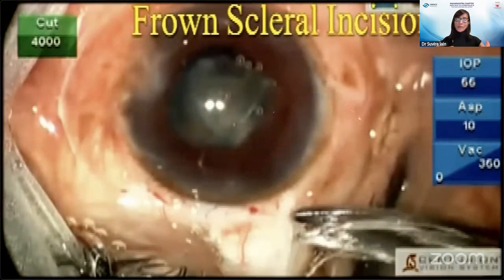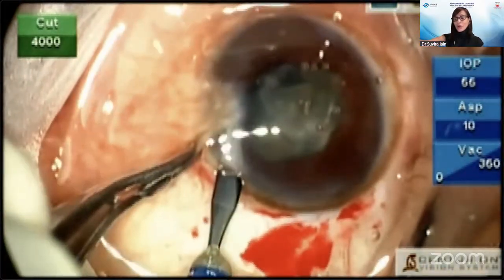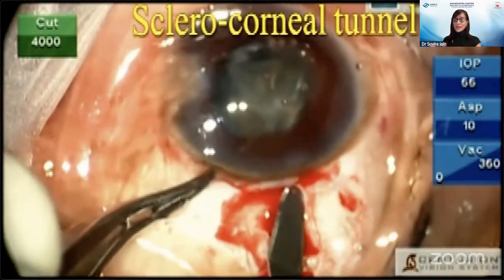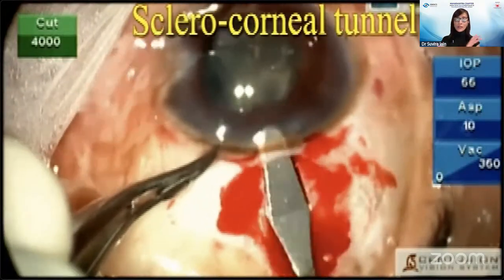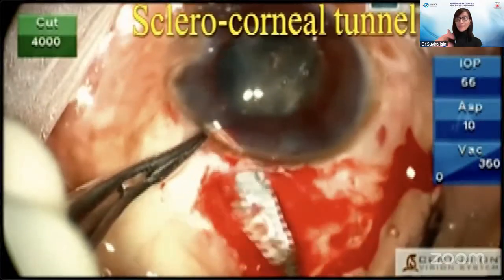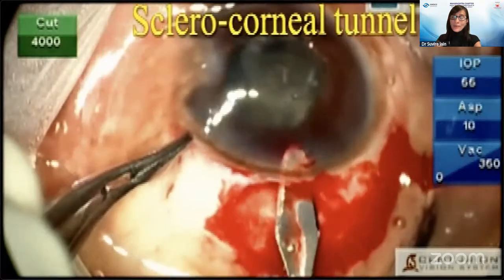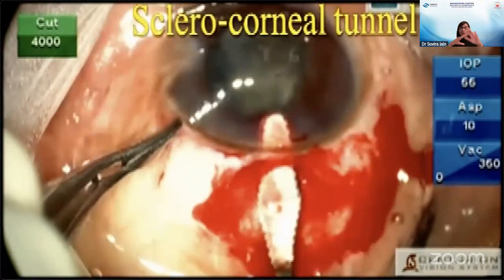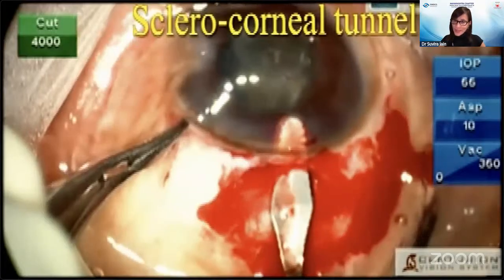Now he has to convert, but because he is a temporal surgeon for phaco, he chooses a completely different site. He shifts superiorly, and now makes a brand new tunnel, completely bereft and clear of the phaco tunnel, which was temporally seen. And this is a dissection of the manual SICS tunnel, as you can see happening. I think personally having either a tunnel and a phaco incision at a different site, or at least at a different level, to be able to achieve a stability of the SICS tunnel, there's wisdom in that.